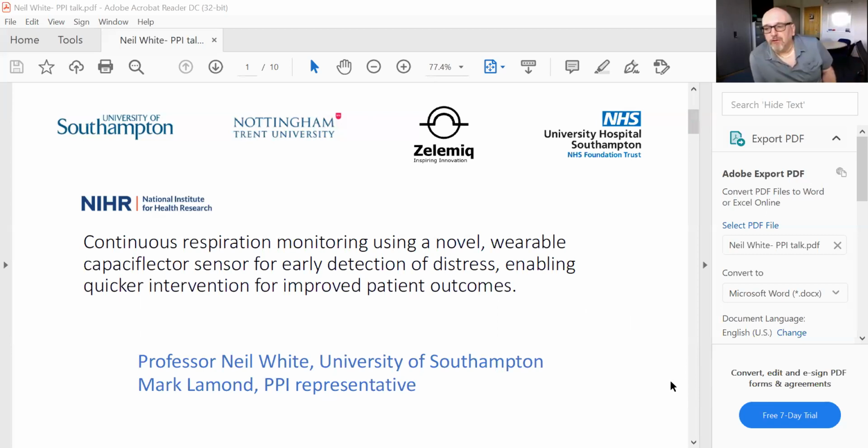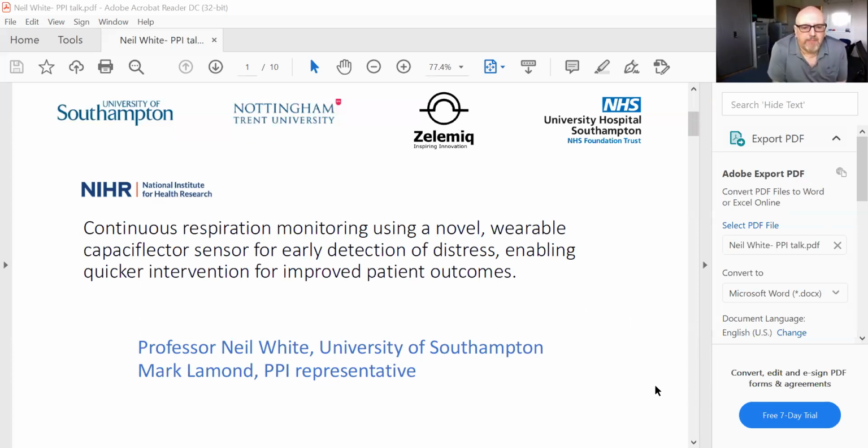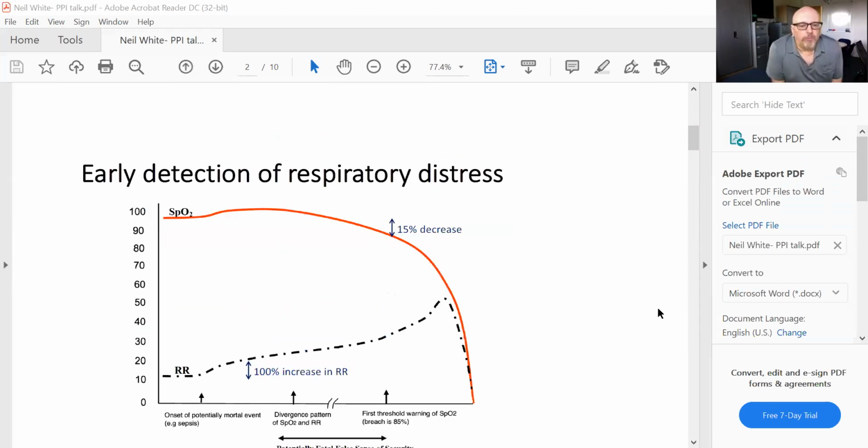So slightly long title. I'm not a fan of long titles, but I was advised that this was suitable, and quite clearly it worked, so we stuck with it. But it's a new type of respiration device that is a wearable system. And one of the features is that it would potentially allow early detection of respiratory distress. So we can detect when people start to breathe heavily, which can be an indicator for some conditions. So can I have the next slide, please, Mike? So for example, that's fine.